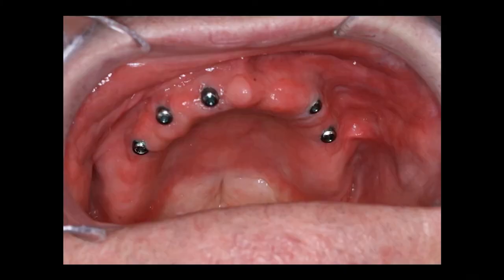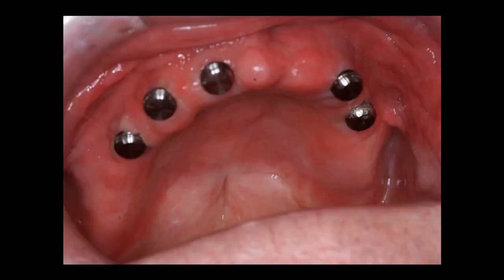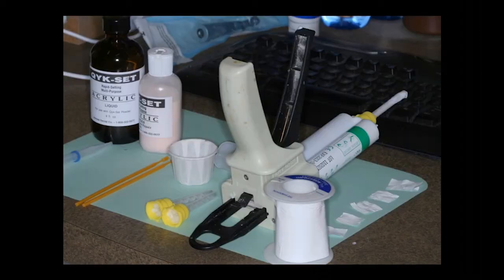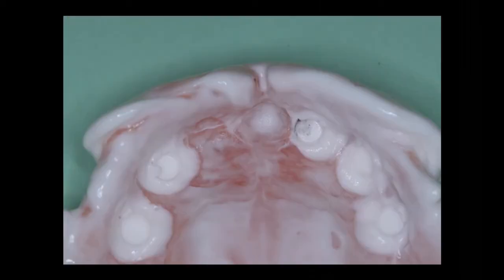Reline this with CoSoft. Let these things heal up real good. Comes in one day. We keep a lot of locators in inventory, so we go ahead and put those into place. Then we're going to take his denture. We're going to wallow out the areas above those locators, check it with Fit Checker to make sure it's seating passively. And we have no pink showing through any of these spots, maybe a little bit right there. So we'll keep relieving this until we're sure this is 100% seated.